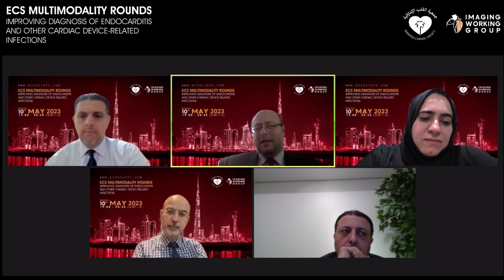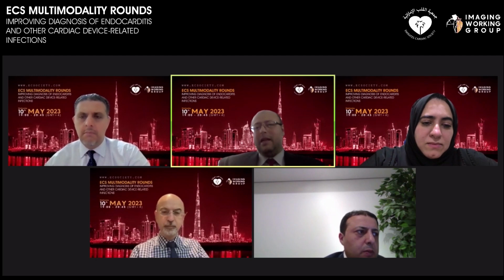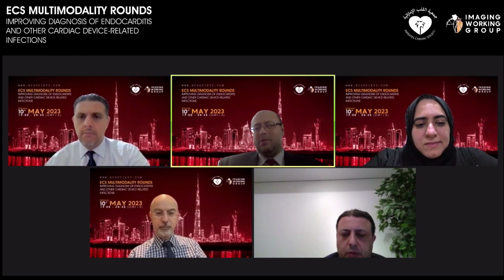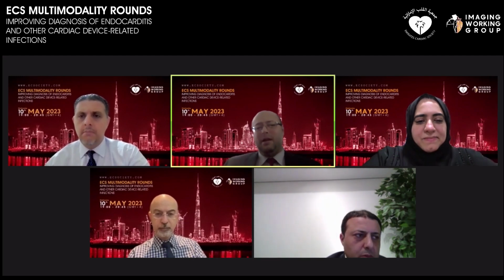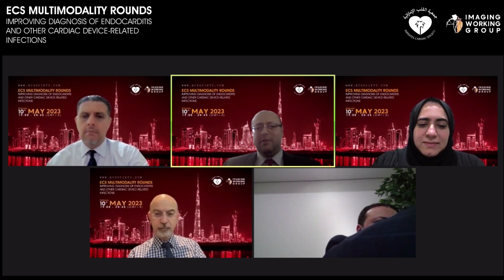But on the other end, for viability, we want to give them as much radio-labeled sugar as we can, and we have insulin on board. Insulin will make the myocytes like FDG or sugar, and they will go ahead and consume it, and then we can detect the viable myocytes. So think of them as exactly the extreme opposites in different situations.